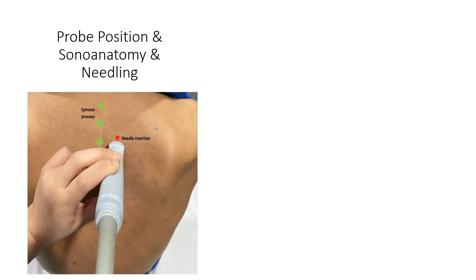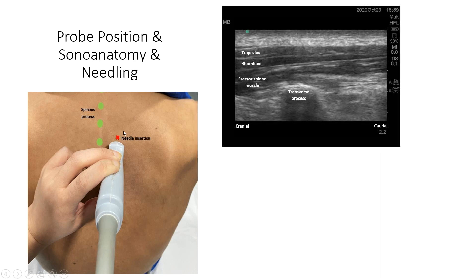For the erector spinae plane block, we first palpate the spinous process, then slowly move the probe laterally by roughly two to three centimetres to get the target view. The transverse process looks like a square acoustic shadow. We identify three important muscle layers: the trapezius, rhomboid, and erector spinae muscle. The rhomboid muscle tapers off and usually ends at T5, so this view most likely corresponds to T4, and lower corresponds to T5.